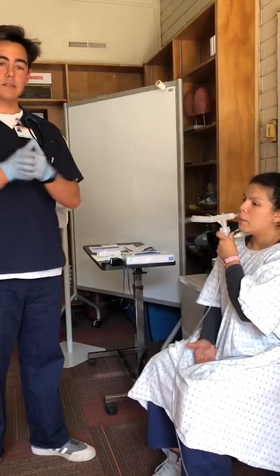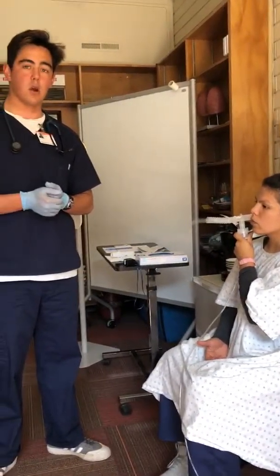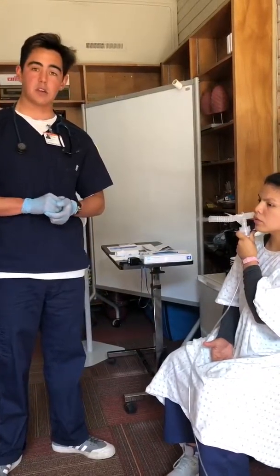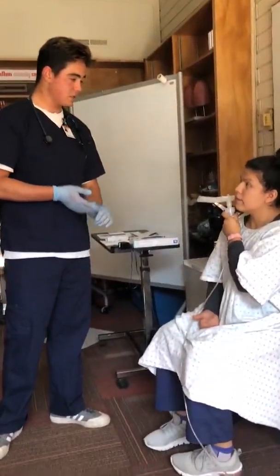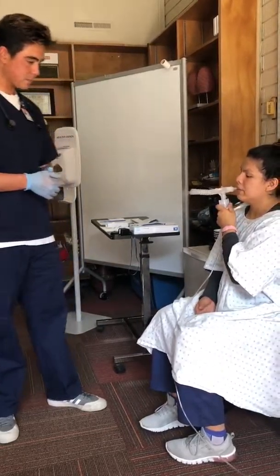Inhalation, max inhalation, and hold for 3 to 5 seconds to deposit into the lower airways. We're monitoring for hyperventilation or hypoventilation, making sure the patient's steady. If at all you feel any of those adverse reactions or those symptoms you're talking about, go ahead and let me know, okay? And we'll discontinue immediately.